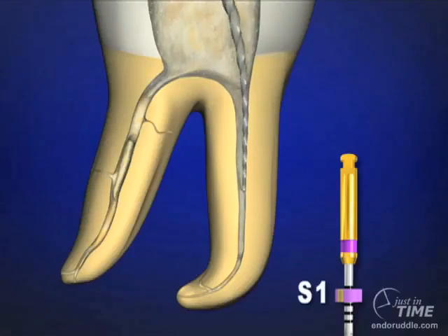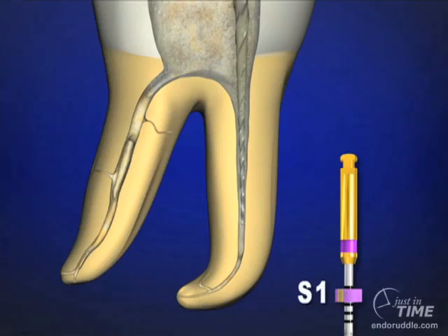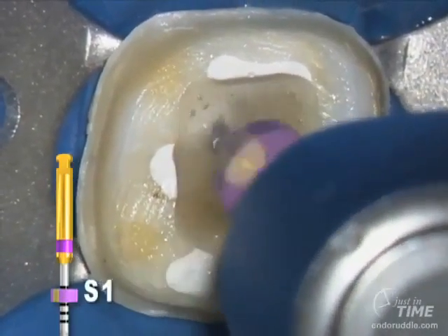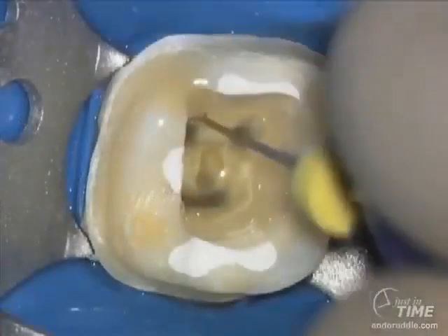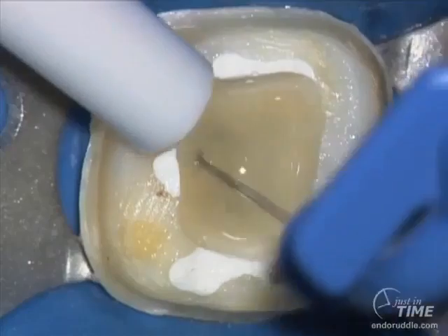It's important to note that by making lateral space, the bigger Eiffel Tower blades of the ProTaper shaping file are free to move deeper. And through a series of brushing and floating and following, the shape can be created and carved out to the level of the glide path. Irrigate, recapitulate with a 10 file to break up debris and to move that debris into solution, and then re-irrigate to liberate that debris. We always work in a bath of 6% sodium hypochlorite.